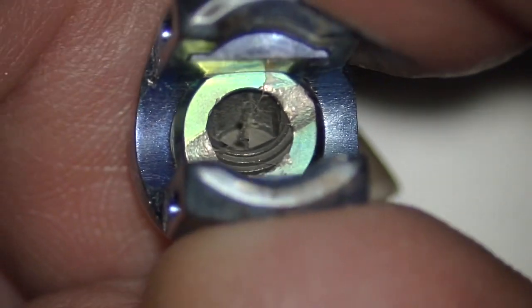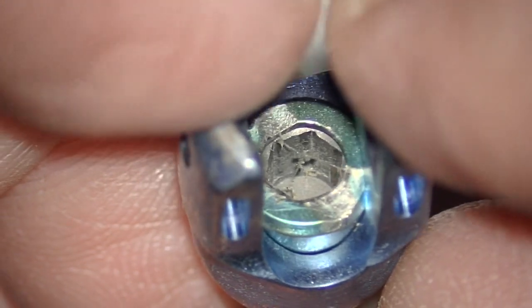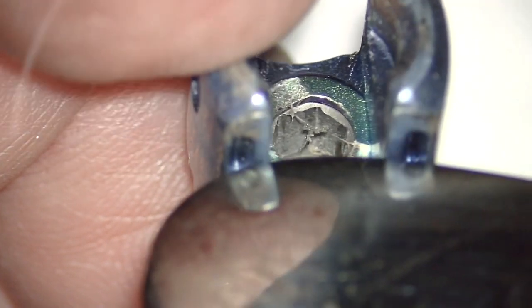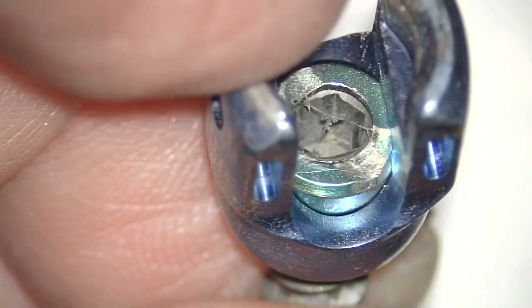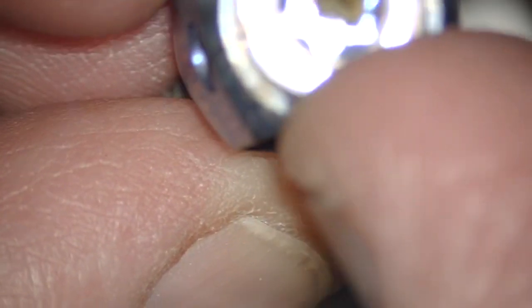So the first thing you do is you turn it 90 degrees, like that, so that you're looking at it immediately. And then you push it over — push it with the cob, usually lateral — so you can see the entire hexagonal female portion of the inner shaft of the screw.